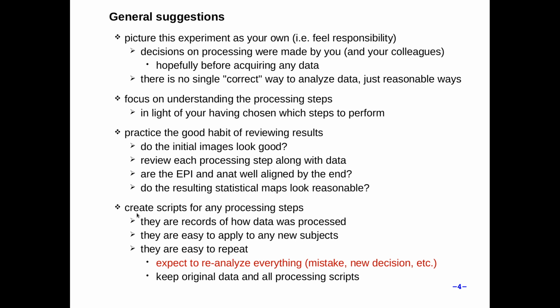So we'll start out by creating scripts for any of the processing steps. Note that that's more than just the single subject analysis that I'm talking about here. I would create scripts for absolutely every step that is done. They are your records of how the data gets processed.